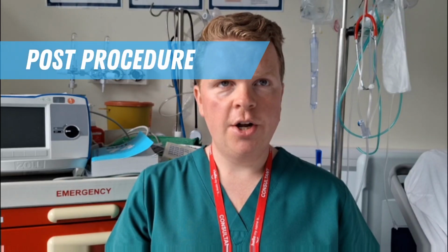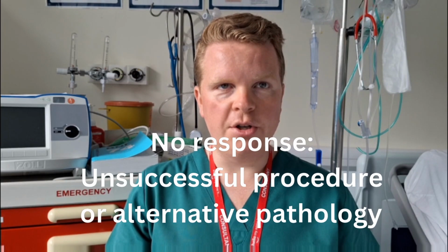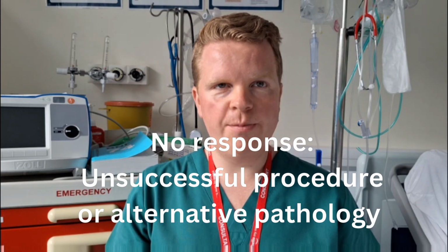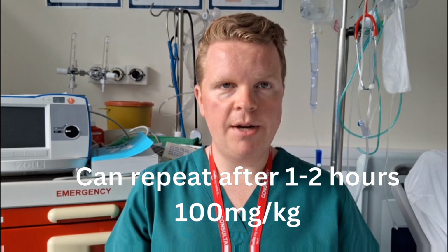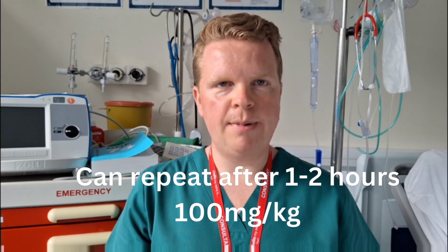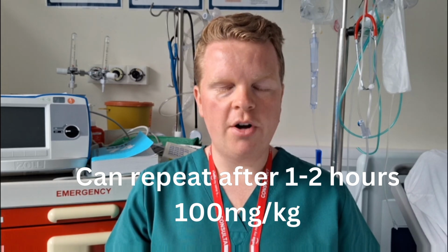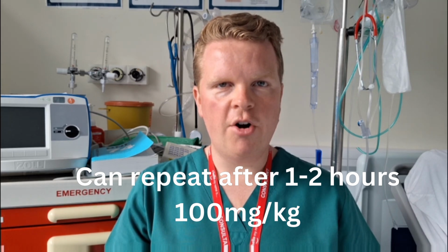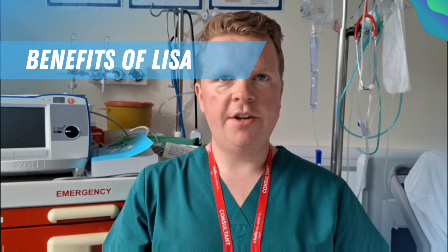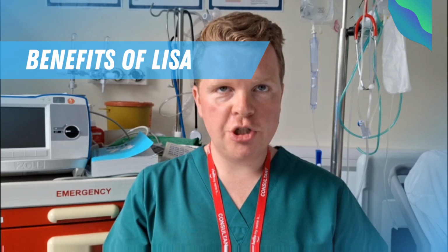After a LISA procedure, observe the baby over the next few hours for improvement. If there is no response or worsening, suspect an unsuccessful procedure or alternative pathology. Surfactant can be repeated after 1 to 2 hours if severe respiratory distress is still suspected, but if this follows a successful dose, a repeat dose of 100 mg per kilogram, rounded to the nearest full vial, should be given instead.